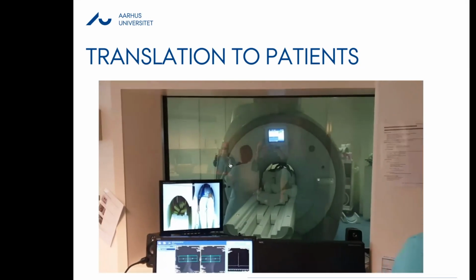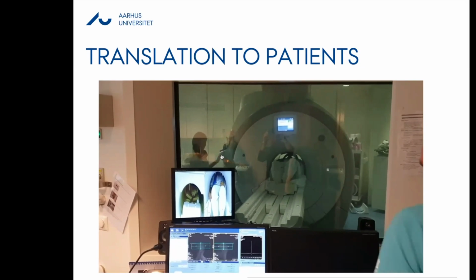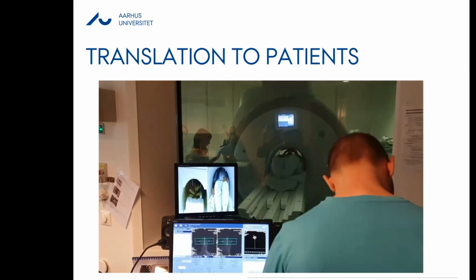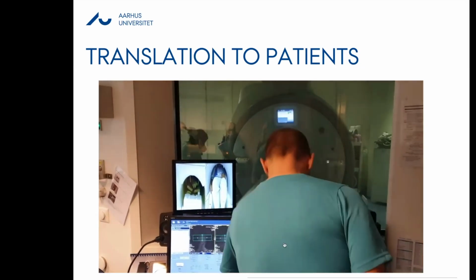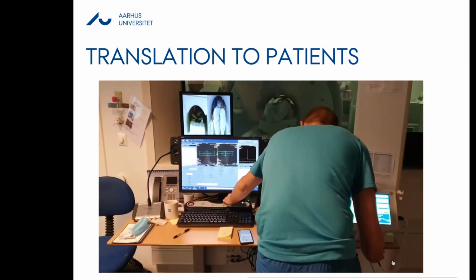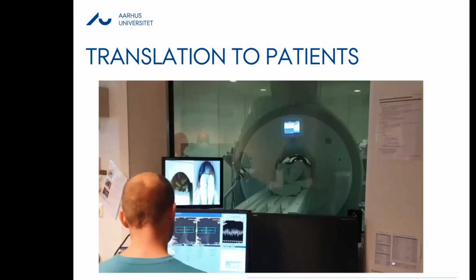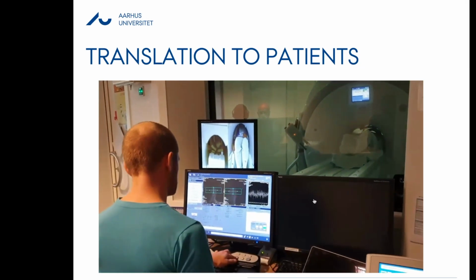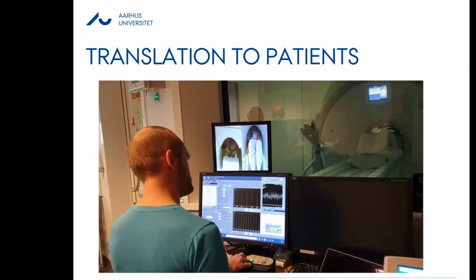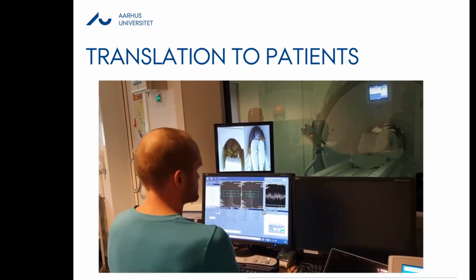And you have Lotte in here placing the syringe, giving the OK, preparing the MedRad power injector, and Nikolai is running the scanner and giving the injection here. And now you see the experiment. So he's looking at it strangely, but nevertheless, this is how the experiment works. So a relatively easy push button setup.